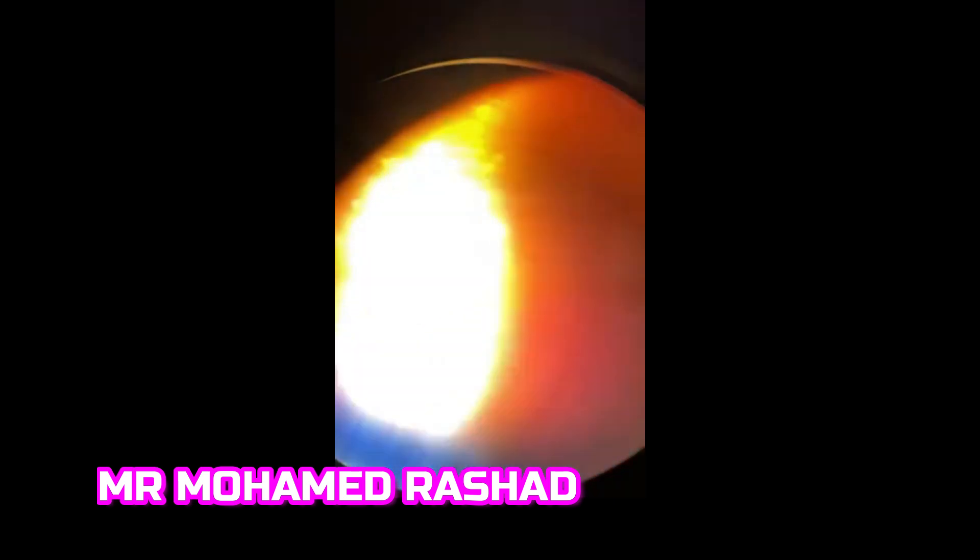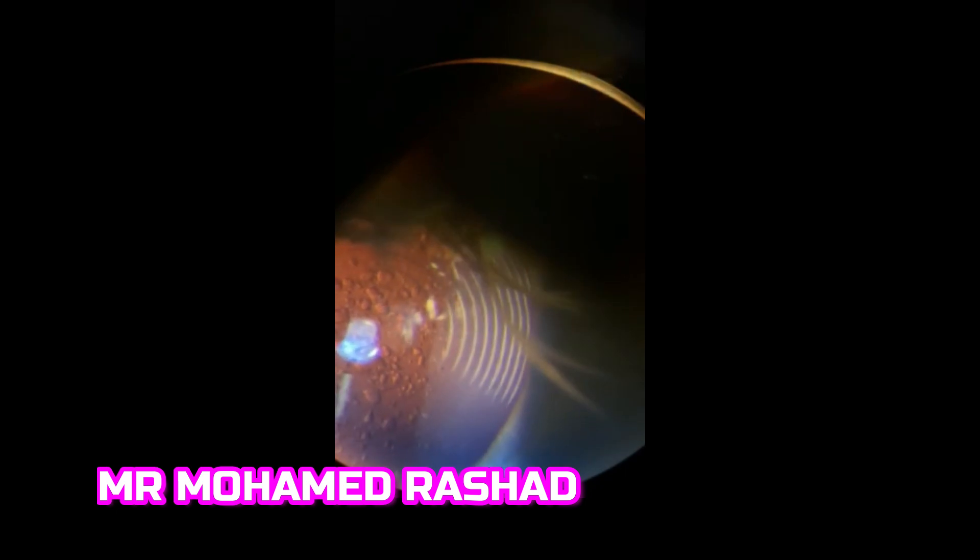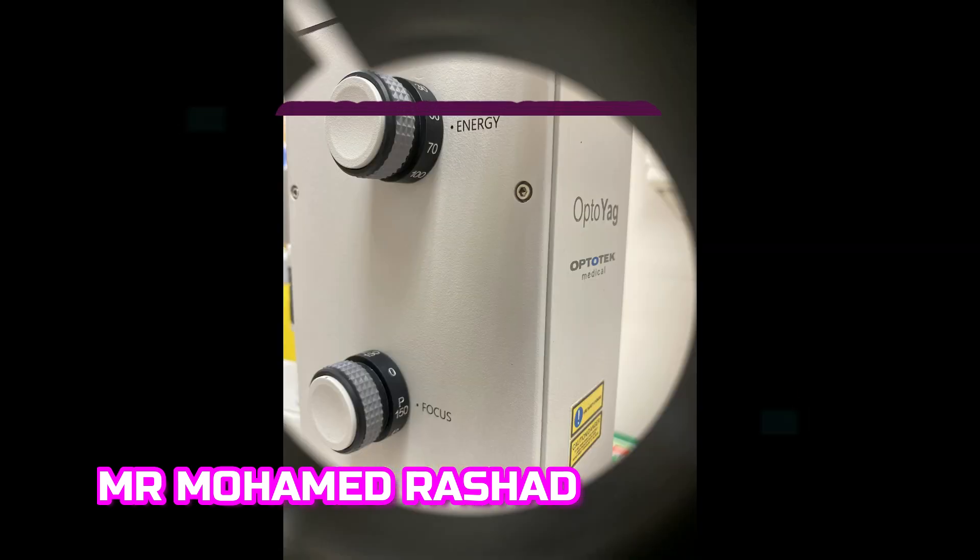During examination, we can see the posterior capsule opacification in the center with retro-illumination and high magnification. You can also see the diffractive rings of the multifocal intraocular lens with the posterior capsule opacification under both direct and retro-illumination.